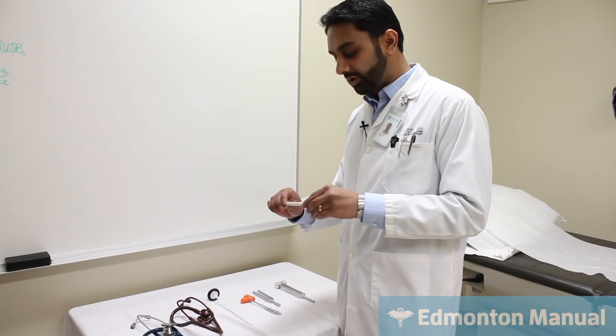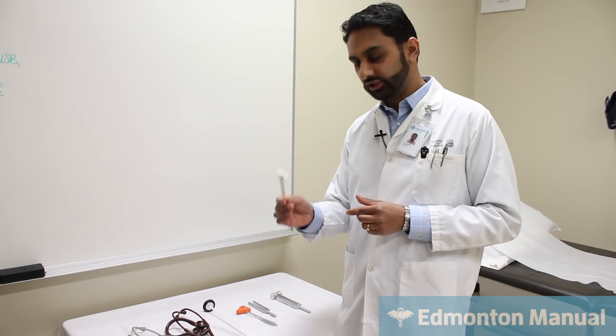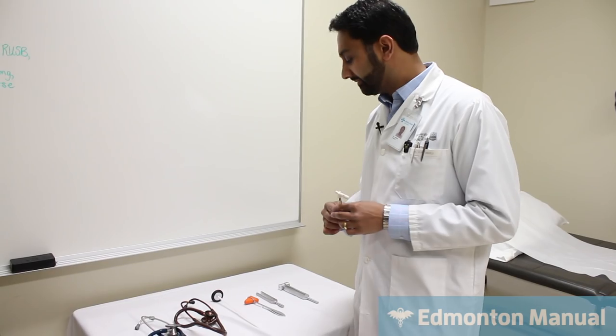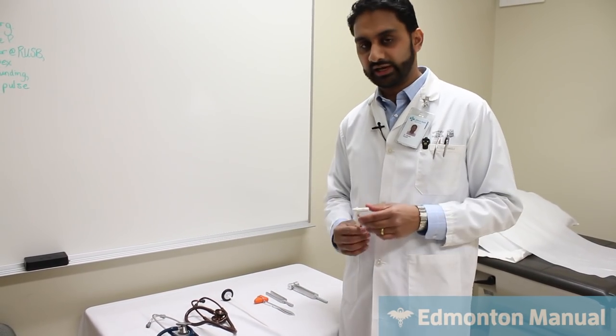And also again with the monofilament, just very carefully cleaning the tip of it after patients and just letting it air out. Just something to think about, especially be quite diligent about it when you're seeing a patient that you know has some sort of transmittable disease.